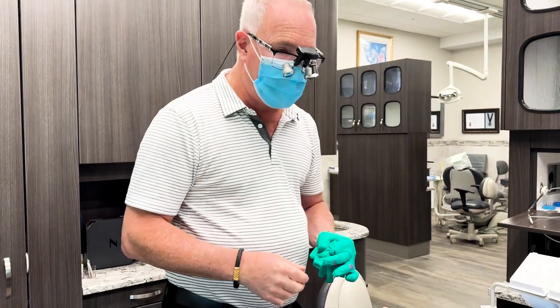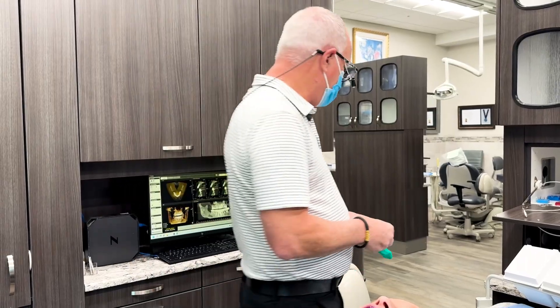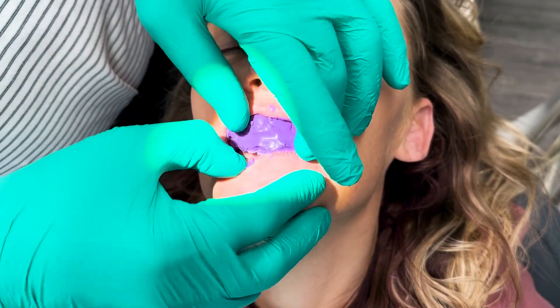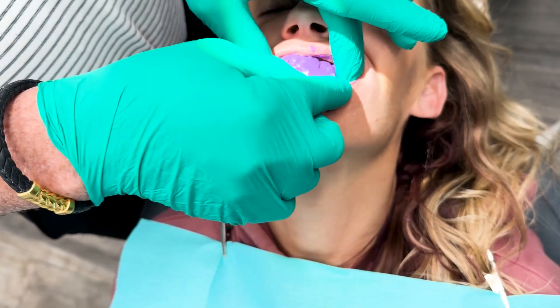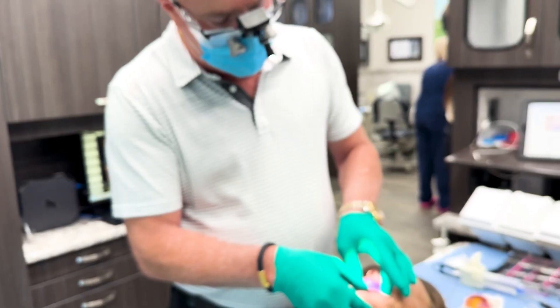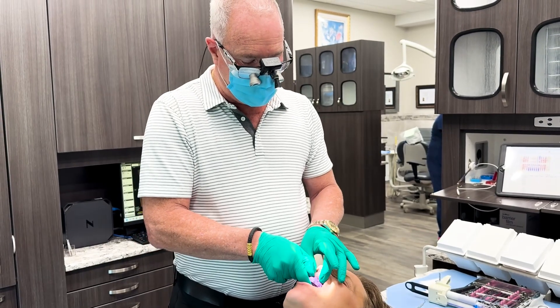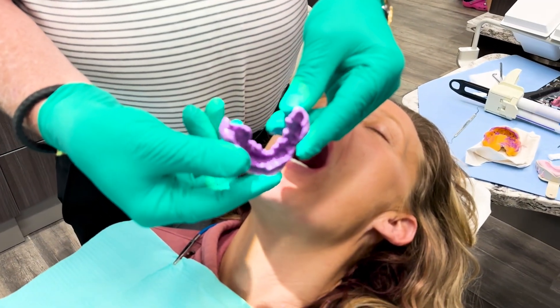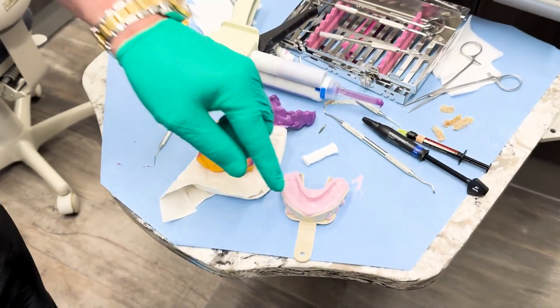Just keep biting. In about 30 seconds we'll take the bite out. Just another 10 or 15 seconds. This is Regisil bite registration material, but you can use whatever product you're most comfortable with — Blue Moose or whatever you like. Okay, open. So here's our bite. Here's our impression, our bite, and our opposing impression.